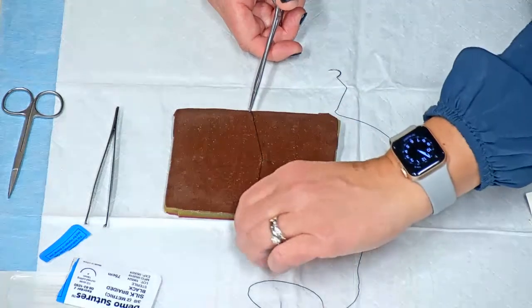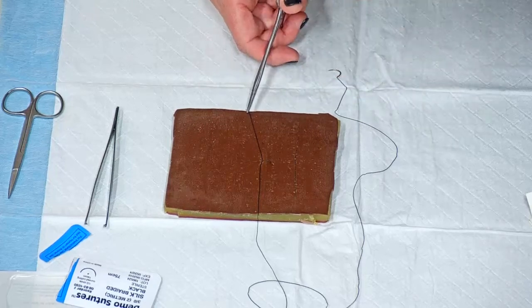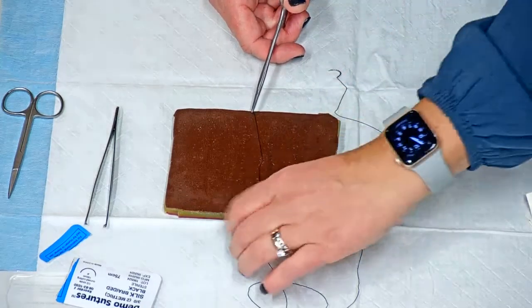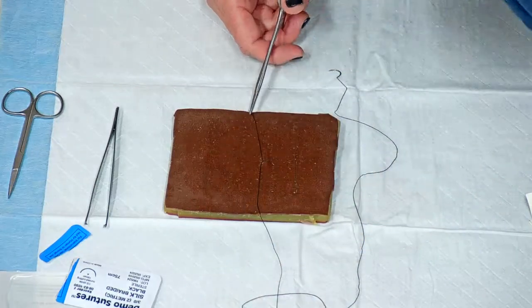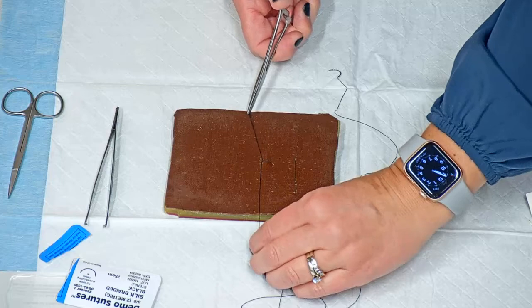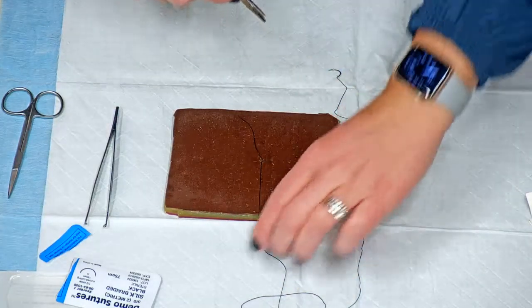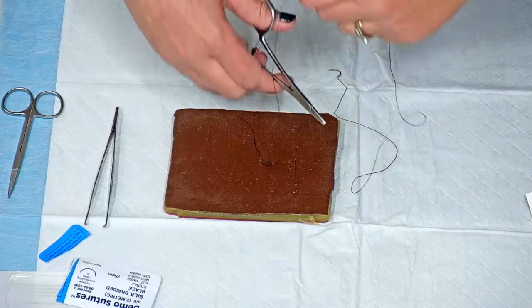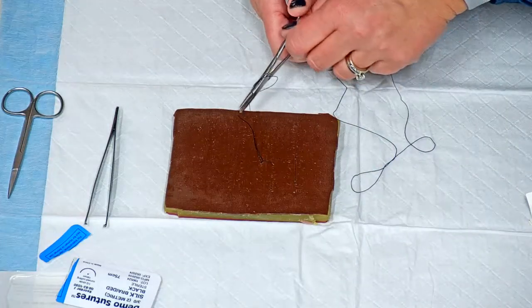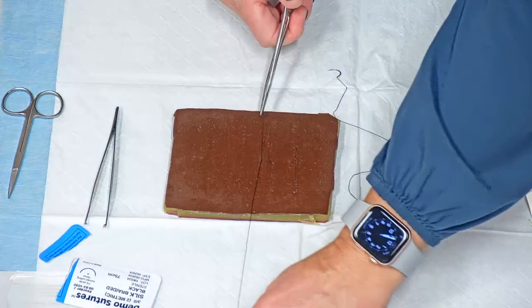You would like to pull it so that there is a slight eversion to the skin that will make sure that the tissue is pulled tight enough that you'll start to have wound healing, but not so tight that it's really strangled down. So just that slight eversion. You're going to release. And like I said, I started away from me. So this time I'll loop it, but I just have to go around once. Just twice that first time. Grab the tail, away.